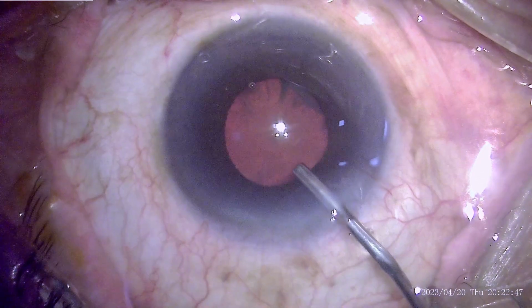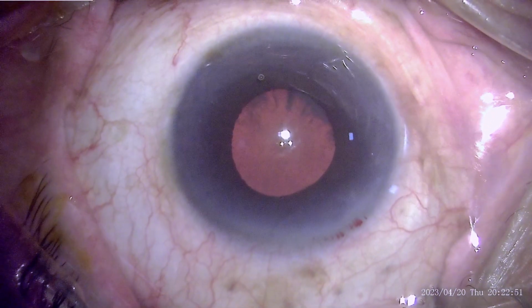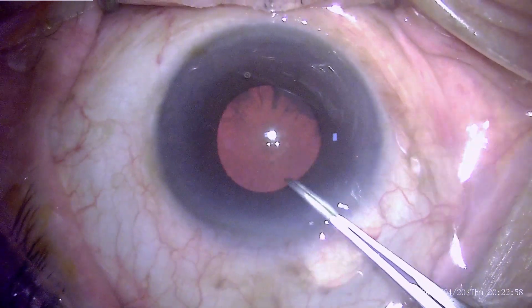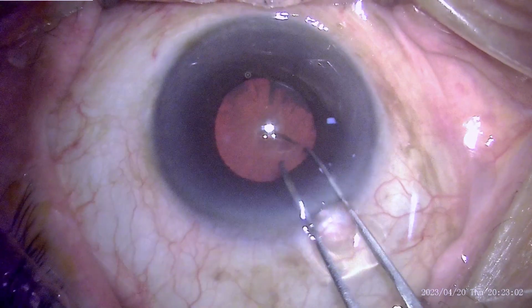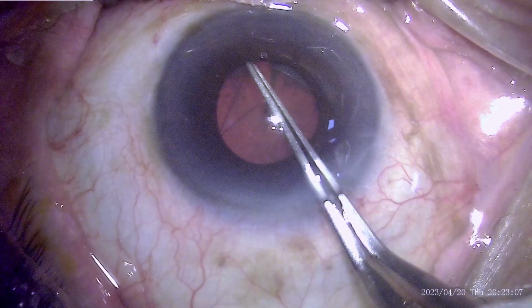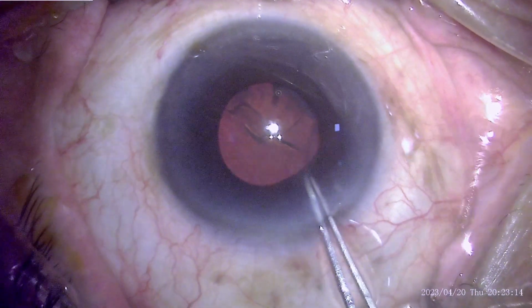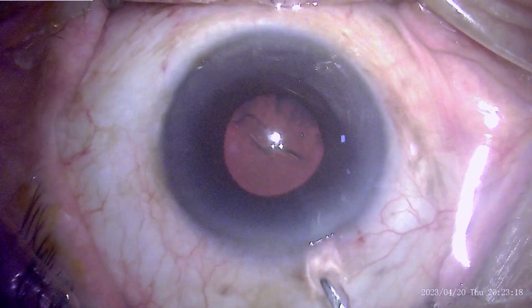Now we are proceeding to the capsulorhexis, and as you can see the pupil is not very well dilated. We will aim for a capsulorhexis of at least 6 millimeters in size. In a scenario where the pupil is not dilated up to the mark, the capsulorhexis has to be done nearly blindly. Just by intuition you have a slight idea where the advancing edge is, and you use these clues to make a capsulorhexis which is done blindly, but is large.